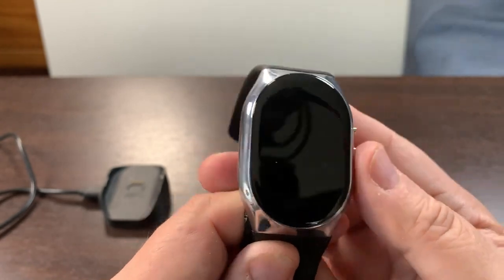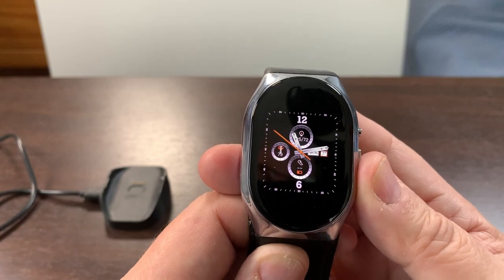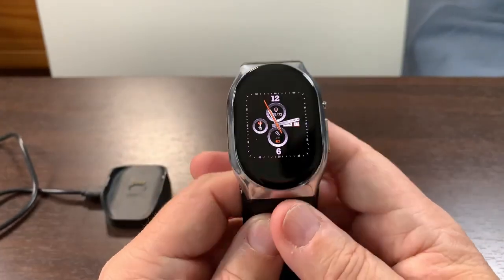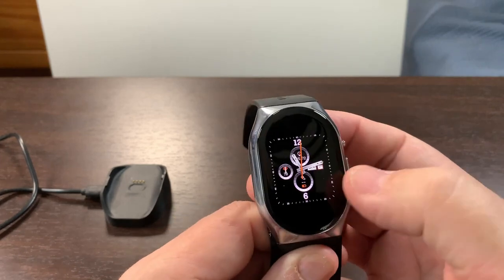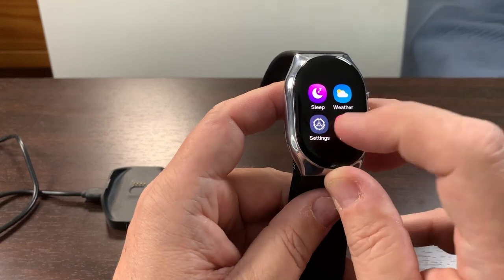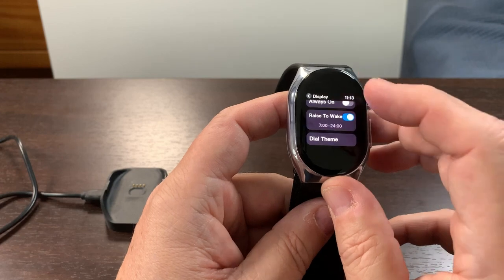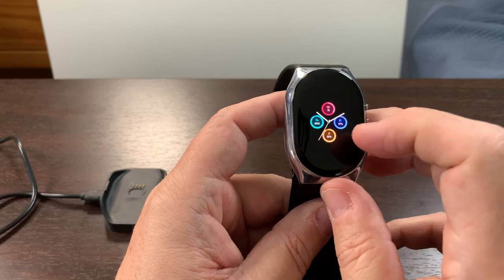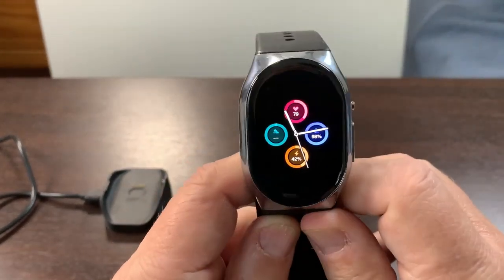It keeps track of steps and heart rate — all the normal things you'd want. It also turns on by the flick of the wrist, and there are different watch faces you can pick. Let's go to the watch faces. You can control the display and the brightness.